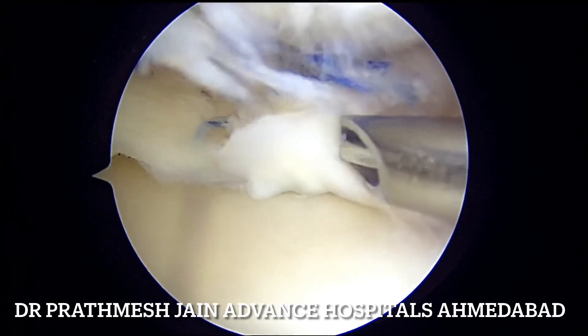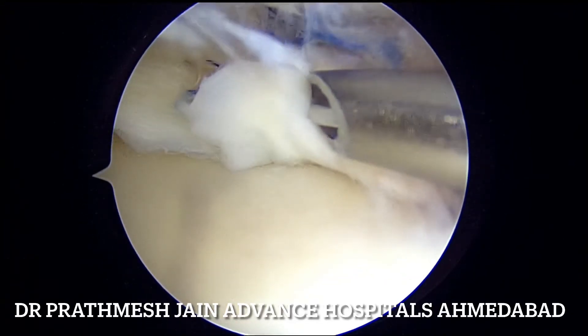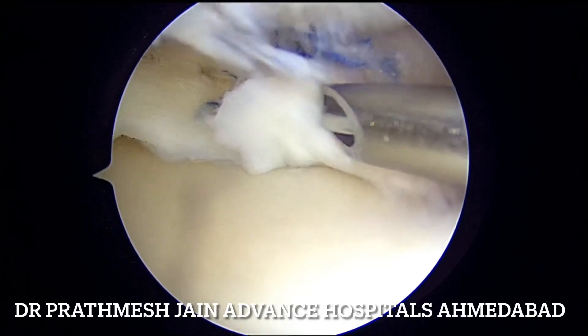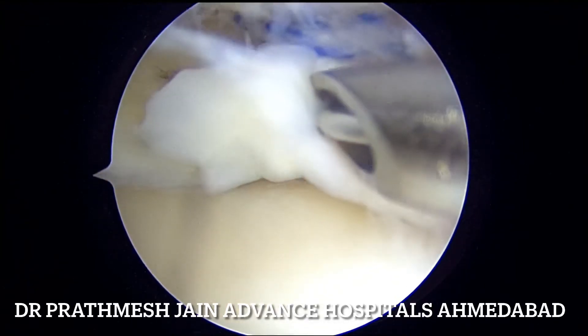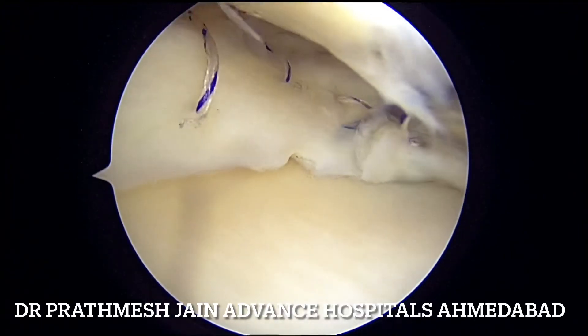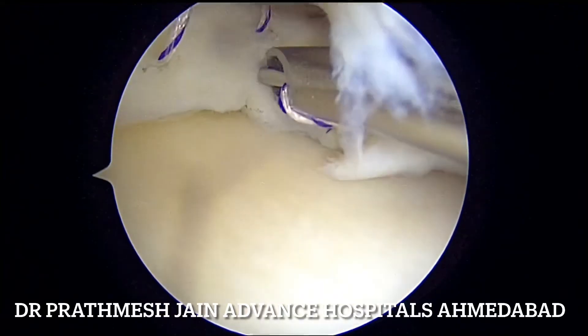After the root fix anchor, you can do side-by-side sutures with the inside-out technique. All these sutures can be tied on the posterior part of the knee with a small incision protecting the saphenous nerve, thereby achieving a very nice repair of this medial meniscus tear using two techniques: the inside-out technique as well as the root fix technique.